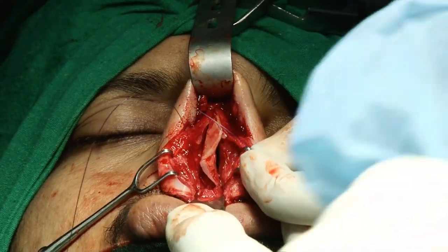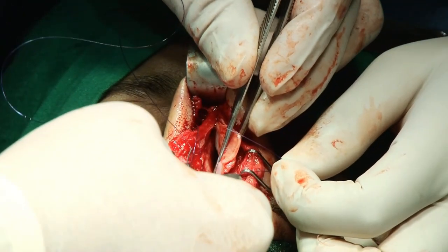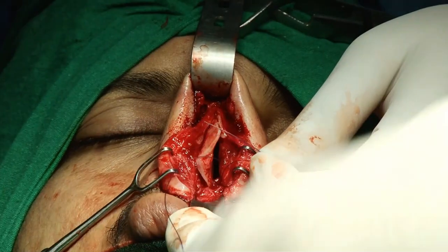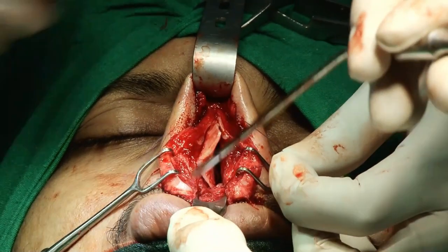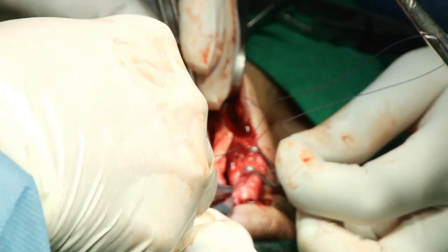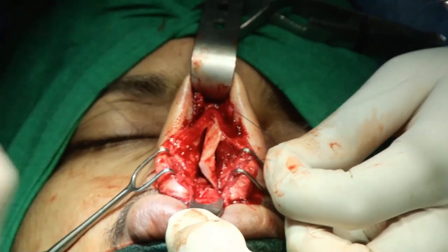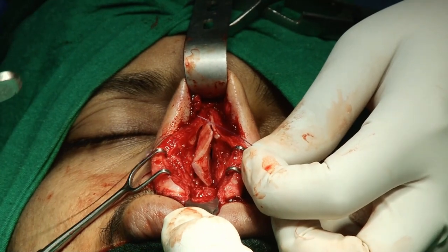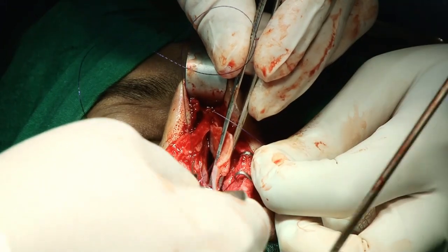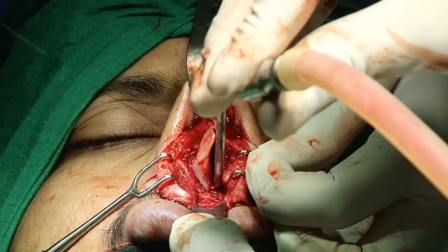And then just go like this. You can make a hole also with a drill, but this technique is easy for a beginner. That's why, because in our patient we have a very small anterior nasal spine, so that is difficult to make it hold. So here we fix it in the midline.